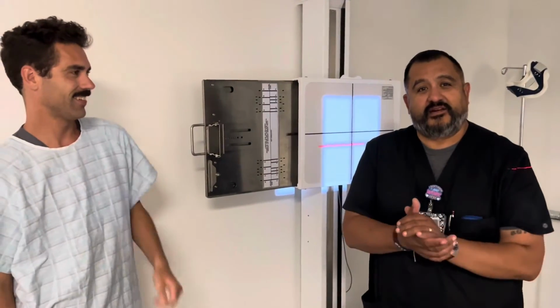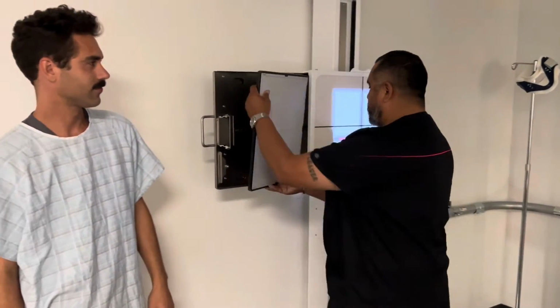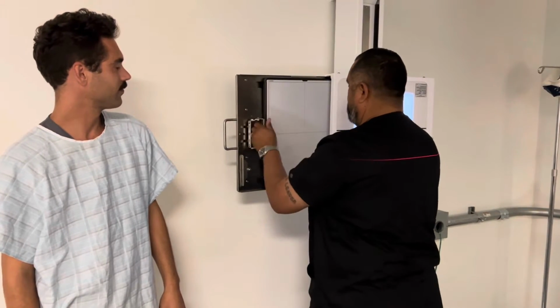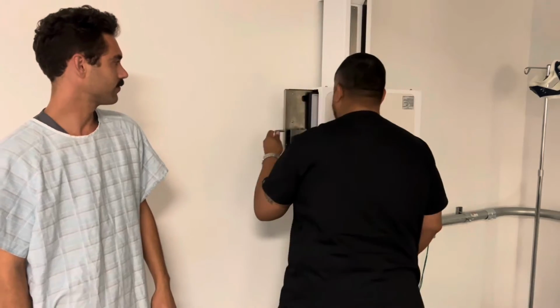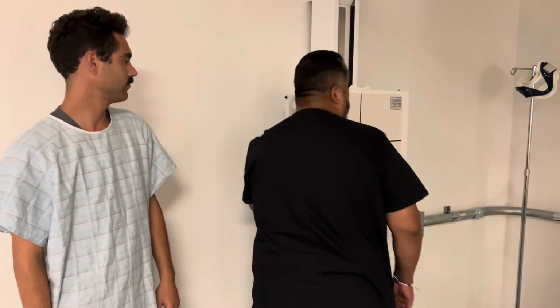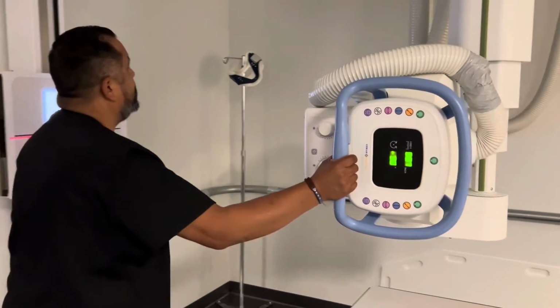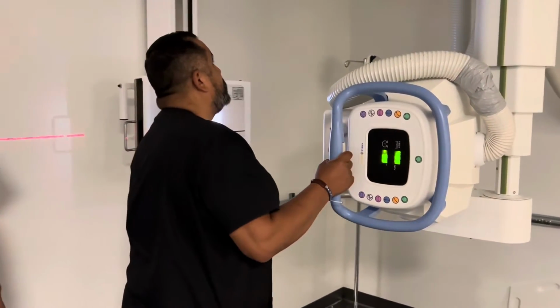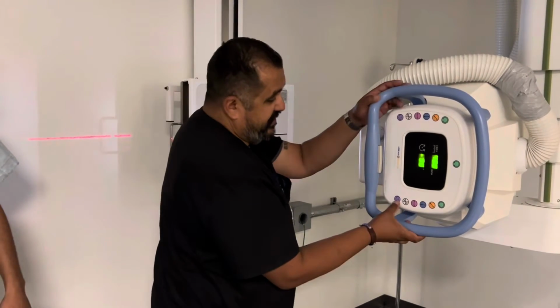We're going to get started here with positioning. We have our patient, and we have our 14 by 17 flat panel detector. It's going to go lengthwise. I'm going to put it about 1.5 inches above his shoulders just to get started. We're going to be doing it at 40 inches SID, and collimation is 14 by 17.